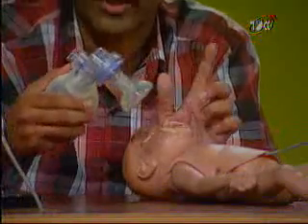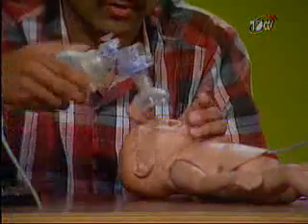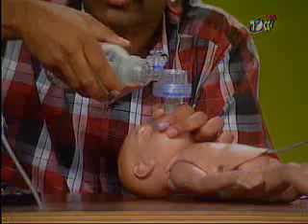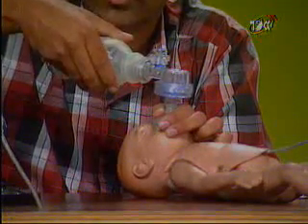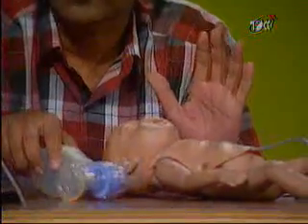The ventilation rate should be about 40 per minute. The simple way to achieve that is to count: one, two, squeeze — one, two, squeeze — giving approximately 40 breaths a minute. So with the baby in the right position, chest beginning to expand, and a rate of 40, after about 20 to 30 seconds you make an assessment.